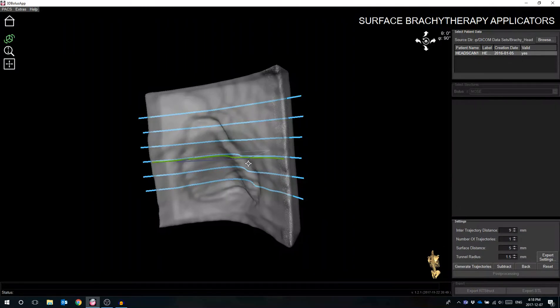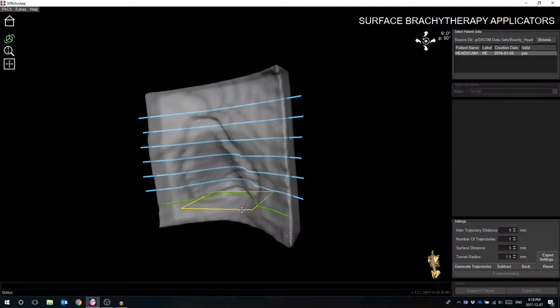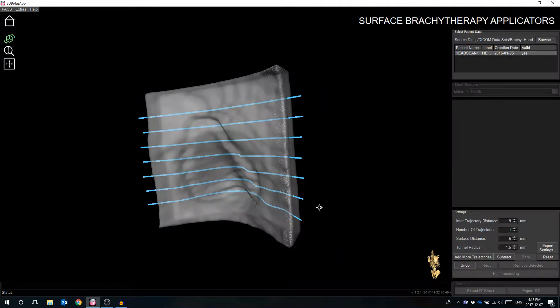The user can add trajectories if they see fit by selecting the Add More Trajectories button, and modify the position of individual trajectories based on the needs of the treatment.